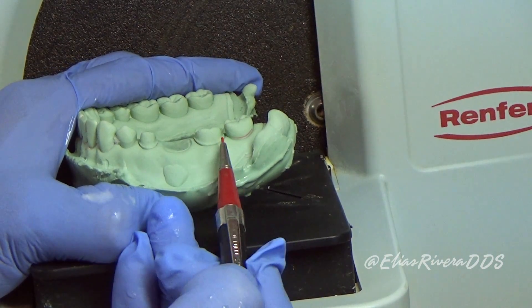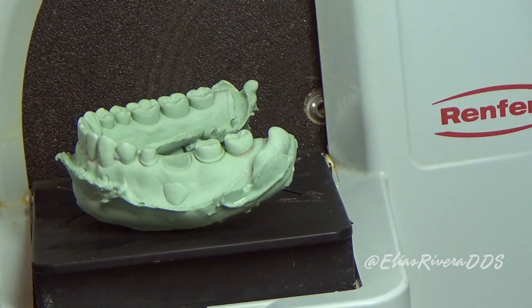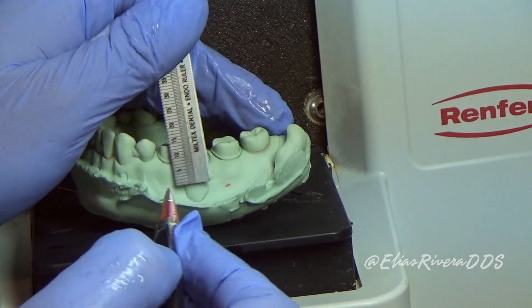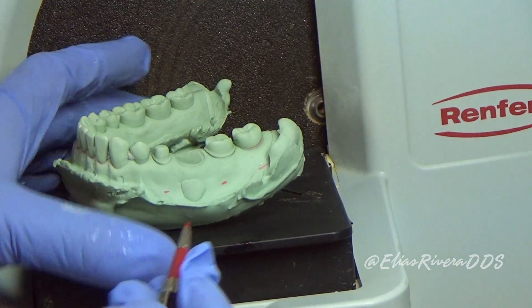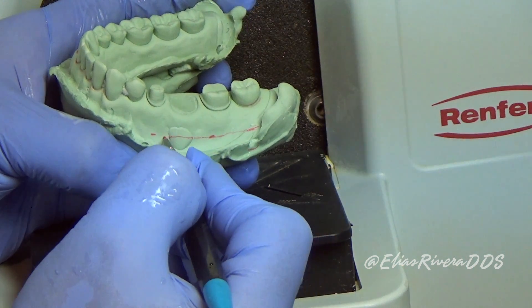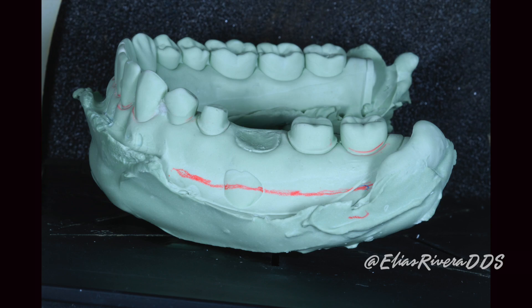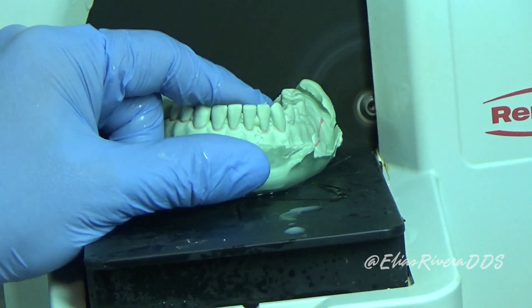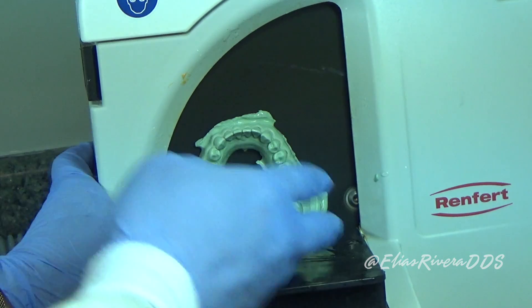Once the stone is set, we're going to measure 10 millimeters from the gingival margins. We're going to mark it using a ruler and a red pencil. Once we have these three dots, we're going to connect them to help us make a line. This line is going to be used as a reference when we start doing the trimming. We're going to repeat the same exercise on the other side. Using a model trimmer, we're going to eliminate the excess of stone, paying attention to that line we made previously.